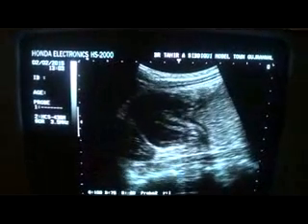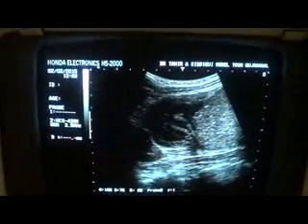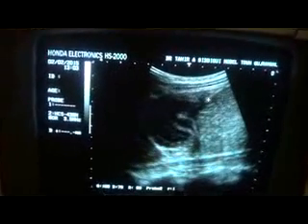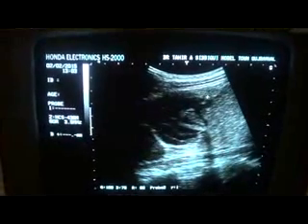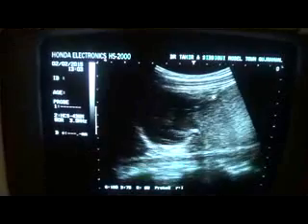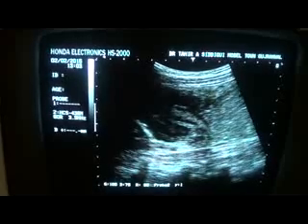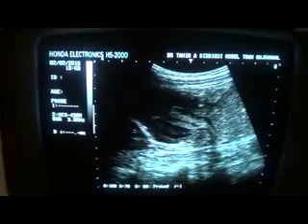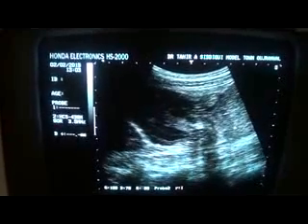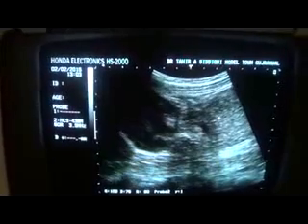Now you can see movement. You can see movement. This is the movement of the distended bowel. It's moving towards this segment. I am going to place the probe stable in one location so that you can see the movement. Here you see this is the movement of the food material and the liquid within this distended bowel.